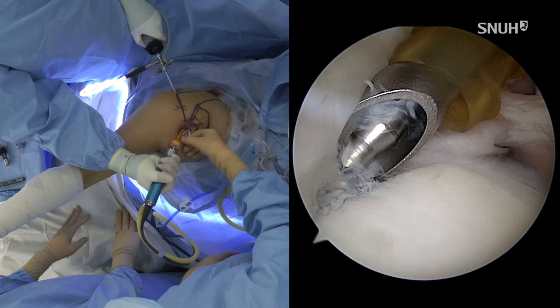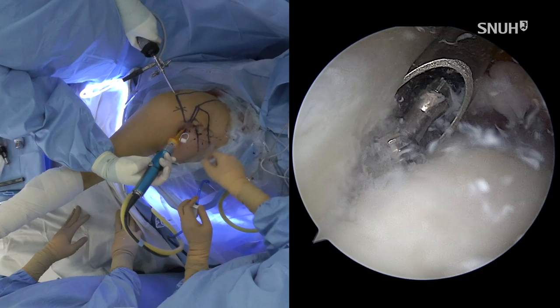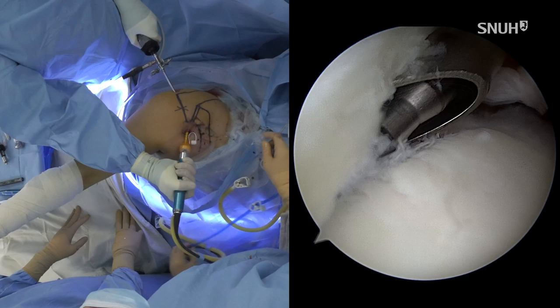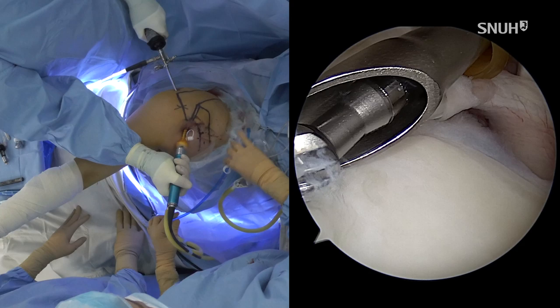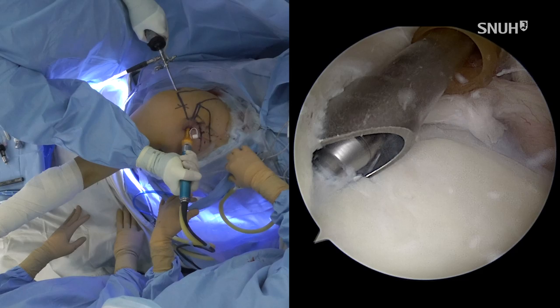I like to expose the subchondral bone to enhance the labrum to bone healing. I like to fix the superior labrum mainly on the posterior side.